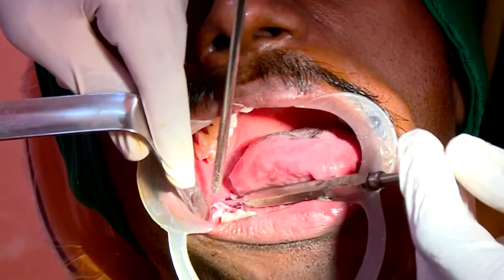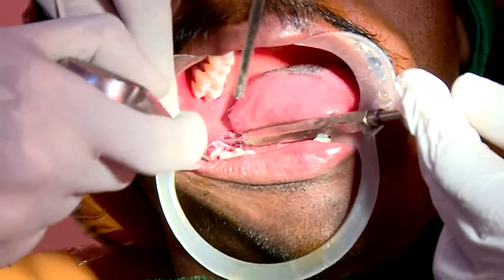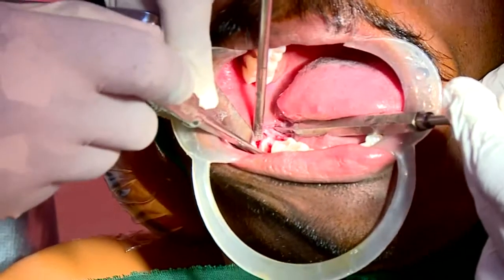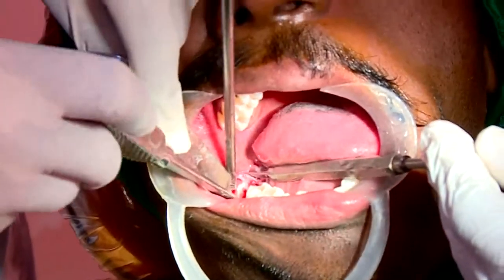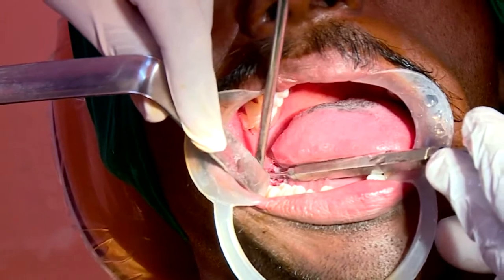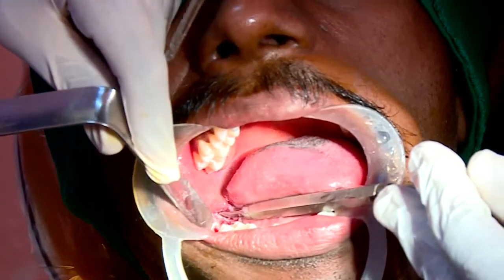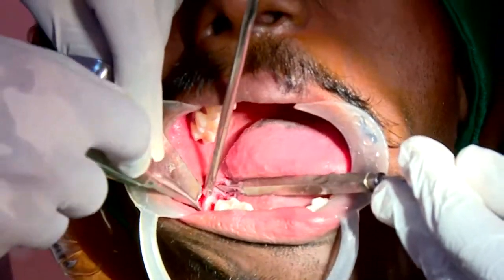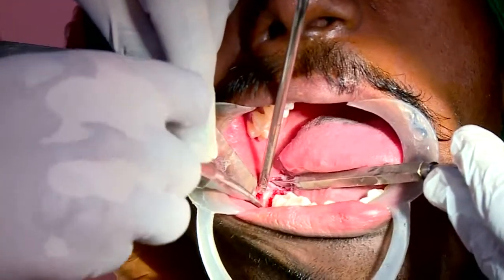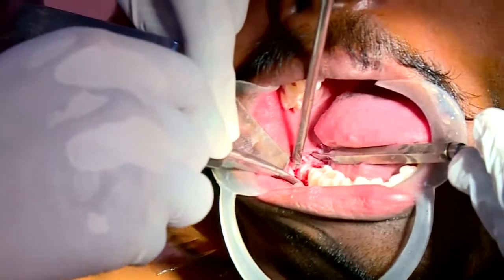Sir, what is the next step you are planning to do, sir? I'm just splitting, removing the wedged root, which is the crown present inside. So what part of the crown is left, sir, that you are removing? Okay. Then slowly, and lift it out. This is slightly moved.